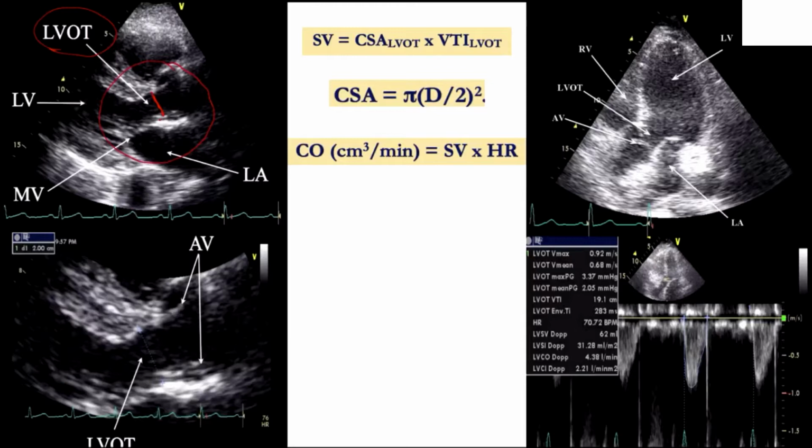So it's very important that when you get your parasternal long axis view, you get a very good view. Make sure you're measuring, see how this is the opening of the aortic valve right here? You want to measure it during systole, and you want to measure perpendicular perfectly, just proximal to these valves. I know this is a simple thing, but I can't harp on it enough. That's going to be your major incorrect measurement if you're over or underestimating cardiac output, and that will be on your board exam, that idea of the importance of measuring the tract distance.